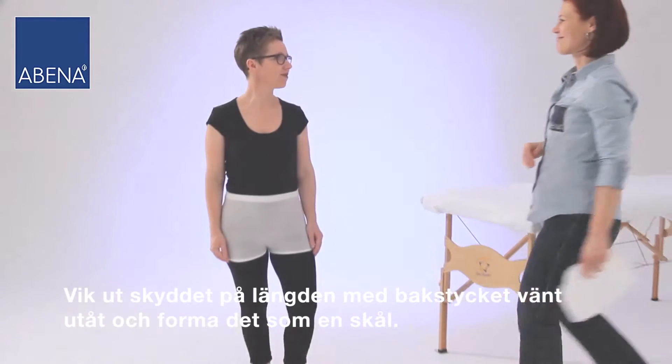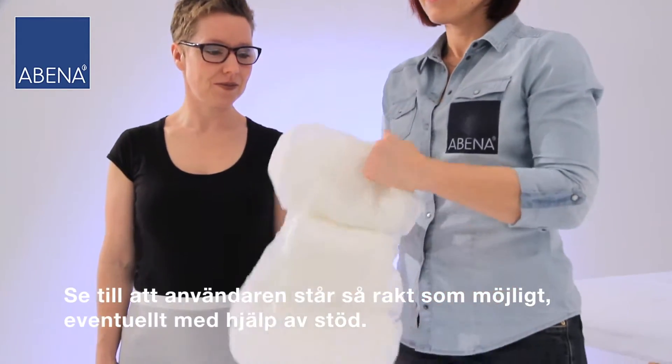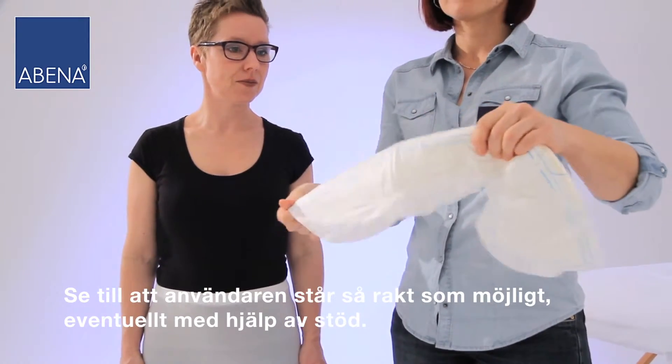Fold the pad lengthways with the back sheet turned outwards and form it like a bowl. Make sure the client stands as straight as possible, possibly with support.